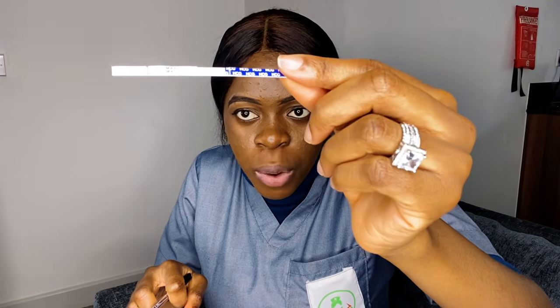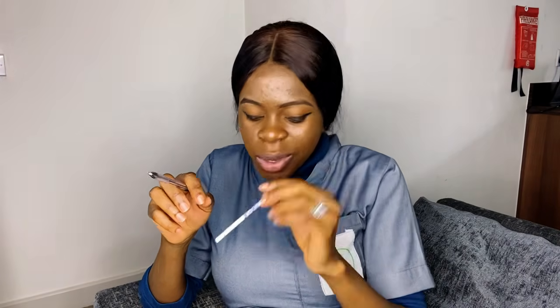You can see this first sample has 2 lines, which shows that you are pregnant. So when your pregnancy test shows 2 lines, it simply means you are pregnant. But there are some situations I have encountered where people are not pregnant, but 2 lines are showing. That's the hormonal problem. That's something we'll discuss later. But generally, you had sex, definitely. So 2 lines simply means you just got yourself pregnant. That guy just impregnated you.